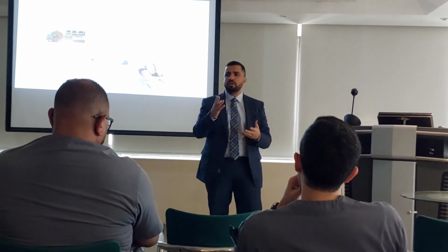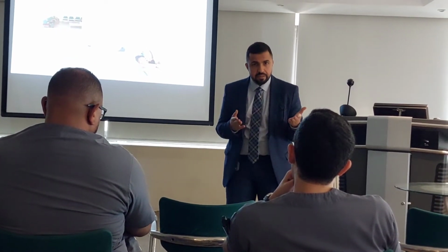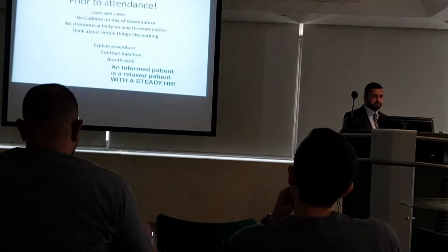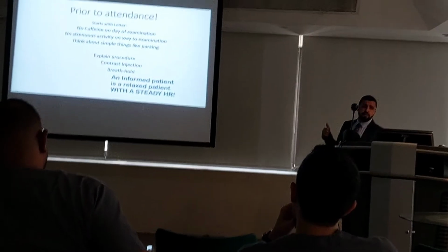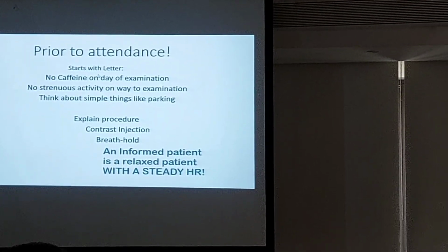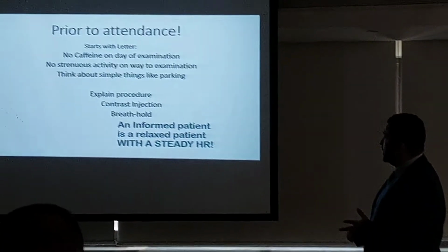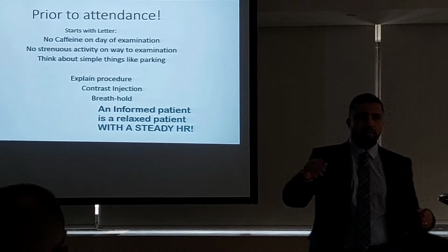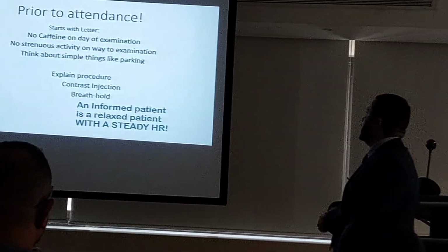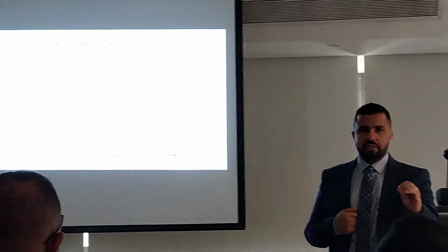You need to think in details. Even the simplest things can compromise your procedure. This is prior to attendance. Start with the letter. It should mention no caffeine and no strenuous activity on the way to the examination. For example, he's jogging and then coming to the appointment. That's not okay. Think about the simple things and explain them.